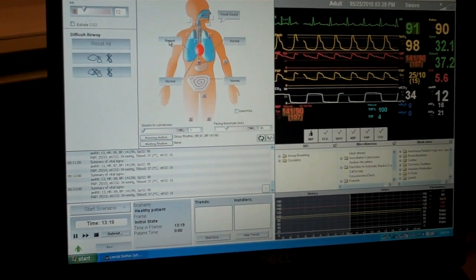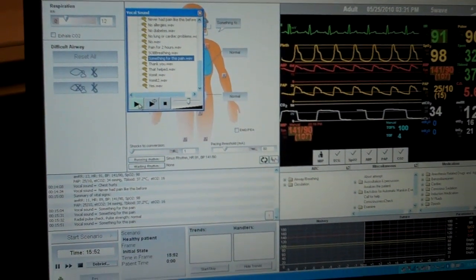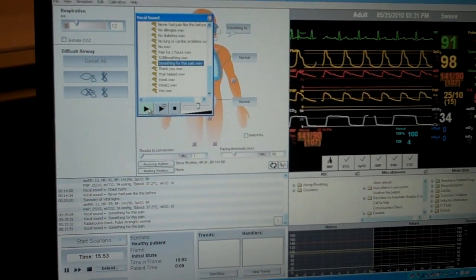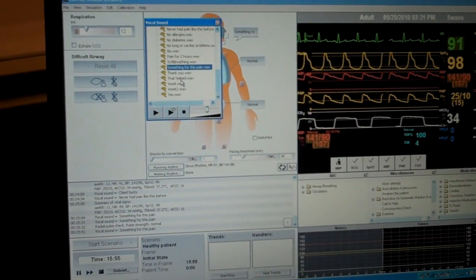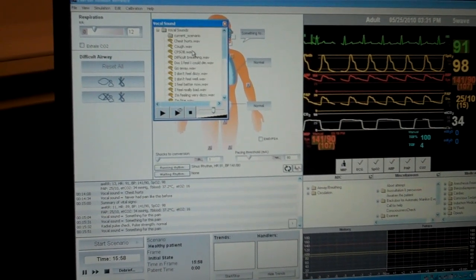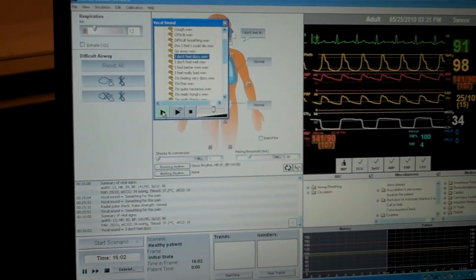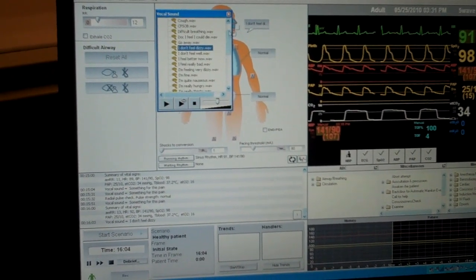Once SimMan gets completely up and running, we can have a microphone in the room and the voice of the instructor can come through as SimMan's voice. We can change all the lung sounds and bowel sounds. We can actually make SimMan talk and you should be able to hear him through the speakers here. There's a microphone in the other room. 'Please, give me something for this pain. It hurts. It really hurts.' And they can go through and ask him all kinds of questions and he can answer them. 'No, I don't feel dizzy.'